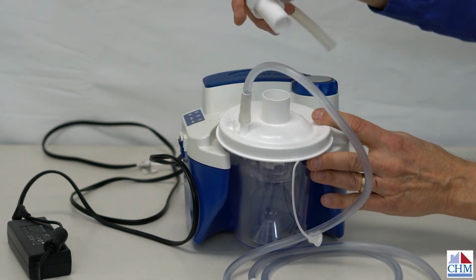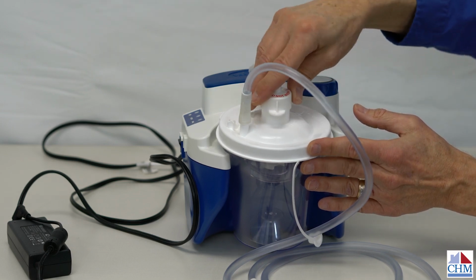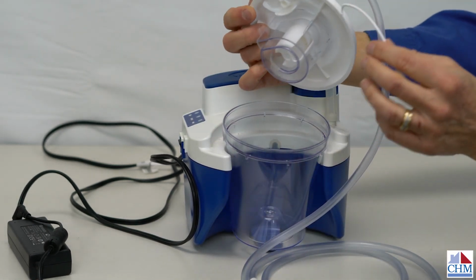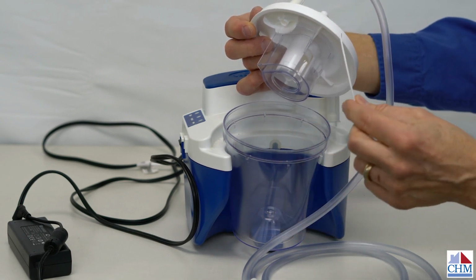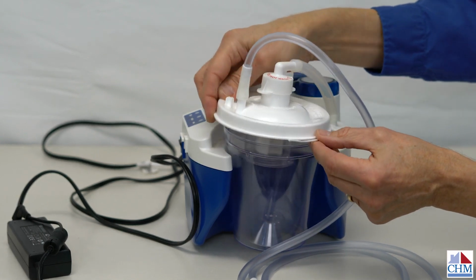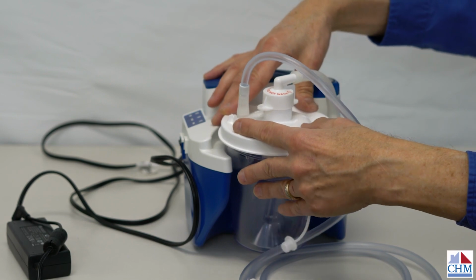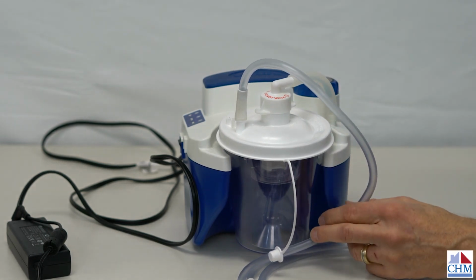With the filter, that's real easy. See if that's wet, exchange it. You could have just an extra filter around, or you can change the entire canister to get a new filter. The other thing to look at is to make sure that you have a good seal with the top of the canister. So this has to be snapped on tight so that it's airtight, and this has to be out of the way. This is a cap that goes on the top here if needed, and sometimes they get stuck in the canister, which of course would make a leak, and you wouldn't be able to build up suction pressure. So make sure that's out. Make sure that this is snapped on tight, and then make sure there's no cracks or anything that would leak within the canister.